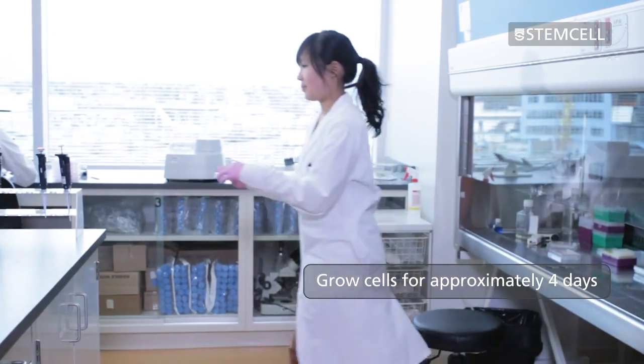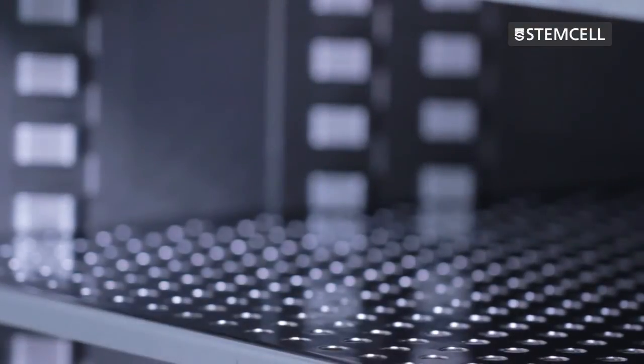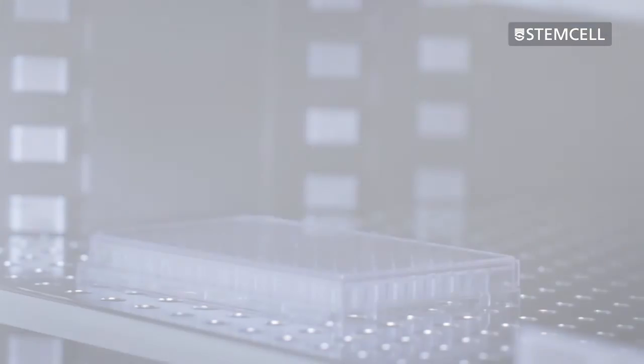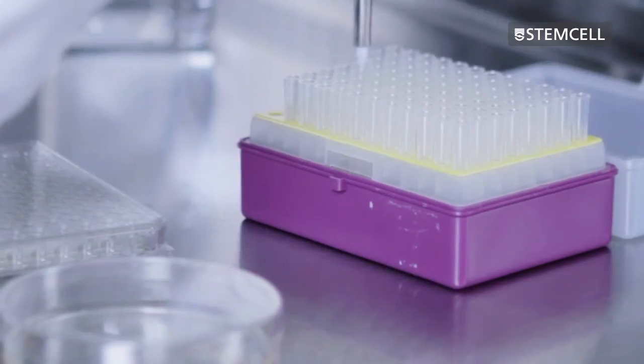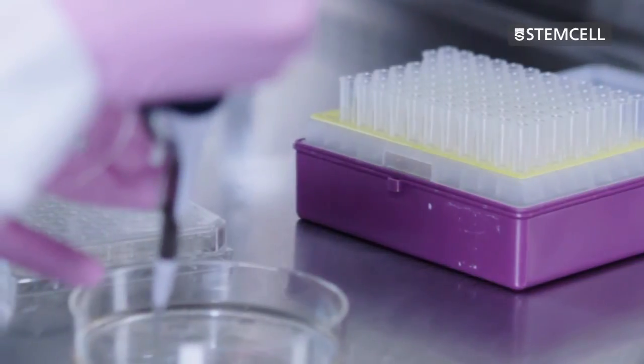Grow the cells for approximately 4 days and then screen for specific protein products using appropriate screening assays. Incubation times will vary depending on the cell type. Because discrete colonies are harvested from the semi-solid medium individually, cultures that test positive for the product of interest have a high probability of monoclonality. This allows you to move on to further stages of cell line development more quickly.